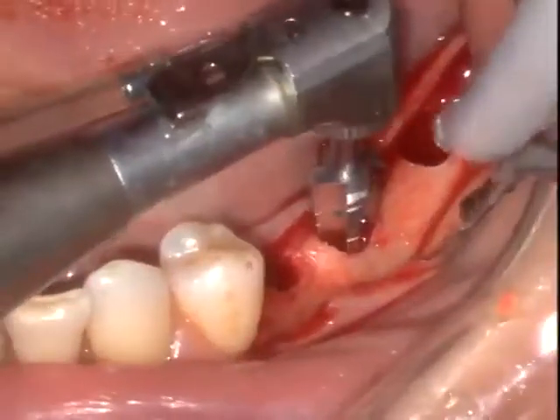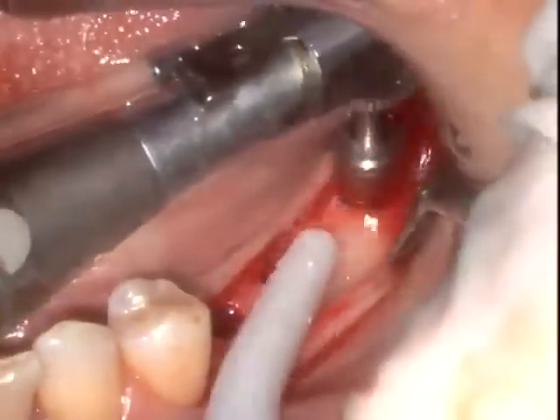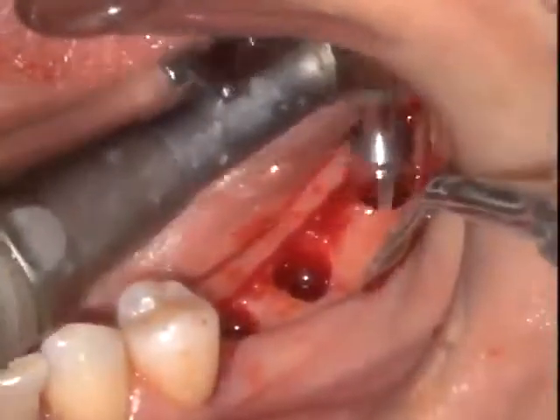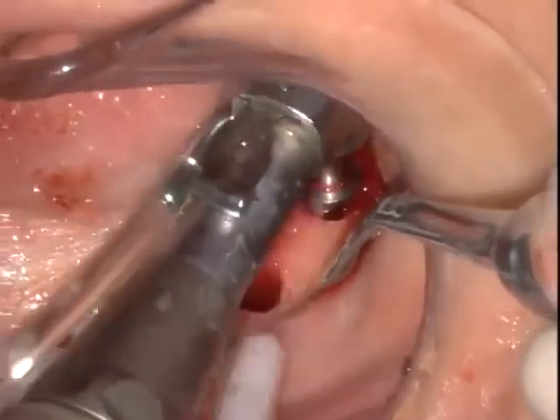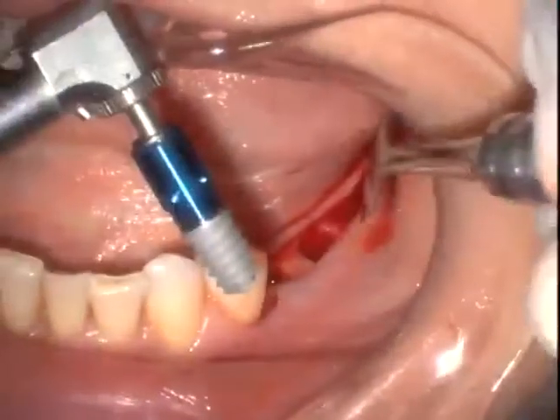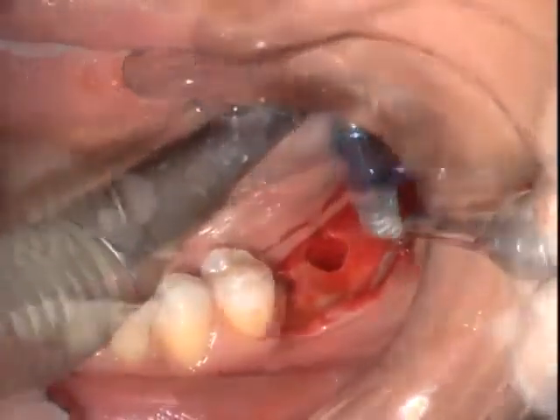These conical drills are given free of charge as part of the implant kits that are distributed by MIS. So these are dedicated conical drills that enlarge the top of the osteotomy to allow for insertion of the appropriate diameter implants. So there's a conical drill for the 3.75, and there's also a conical drill for the wider 5.0 millimeter implants.